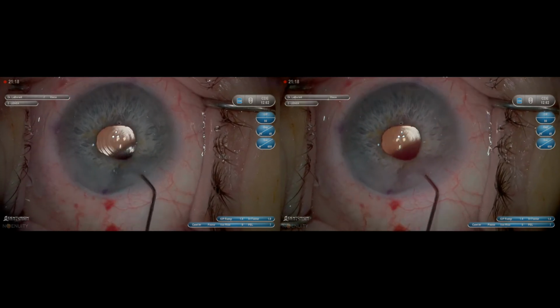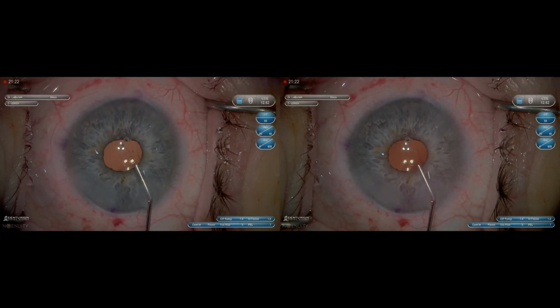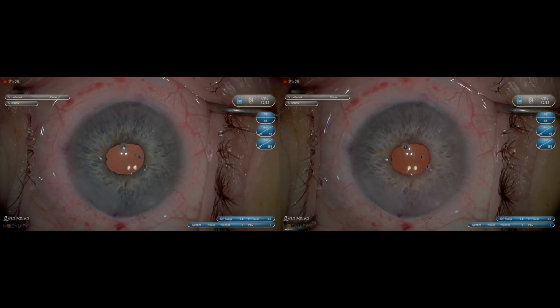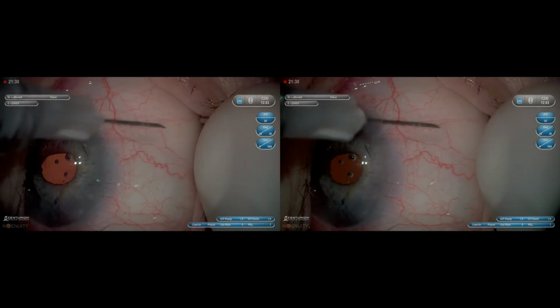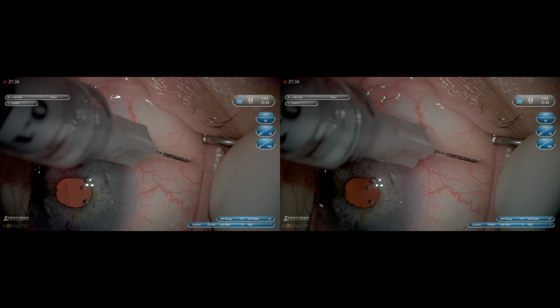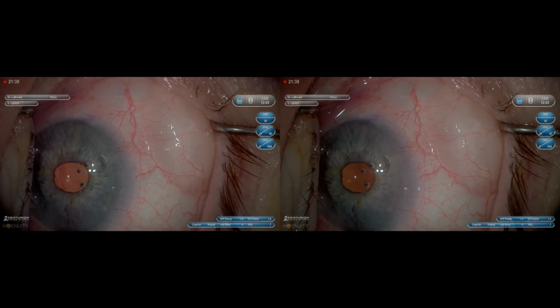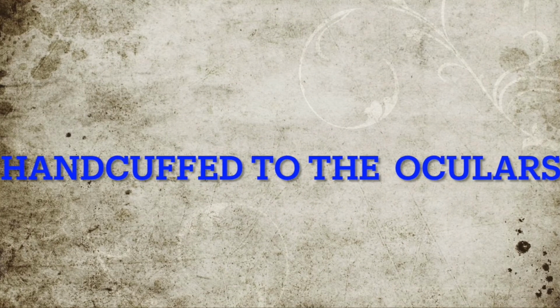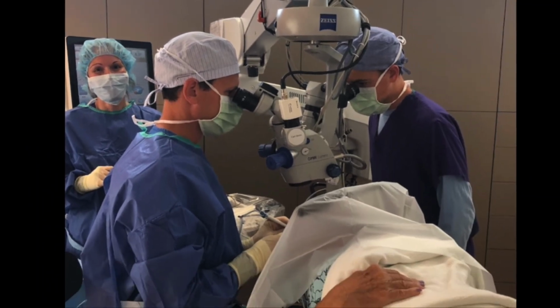Since this is a drop-free cataract surgery, I'm injecting anterior chamber moxifloxacin, followed by 0.15 subtenon's Kenalog, which is placed with the patient looking down 8 millimeters supranasal to the limbus. Again, notice I did not have to adjust my focus. I just at this point wanted to highlight some advantages with the Ngenuity system.